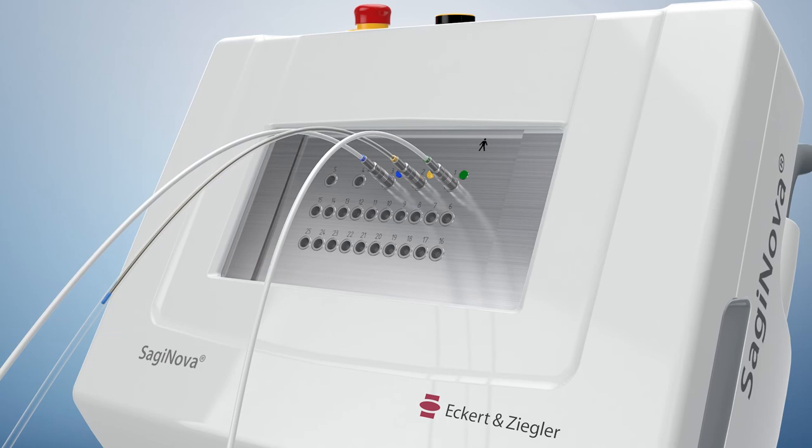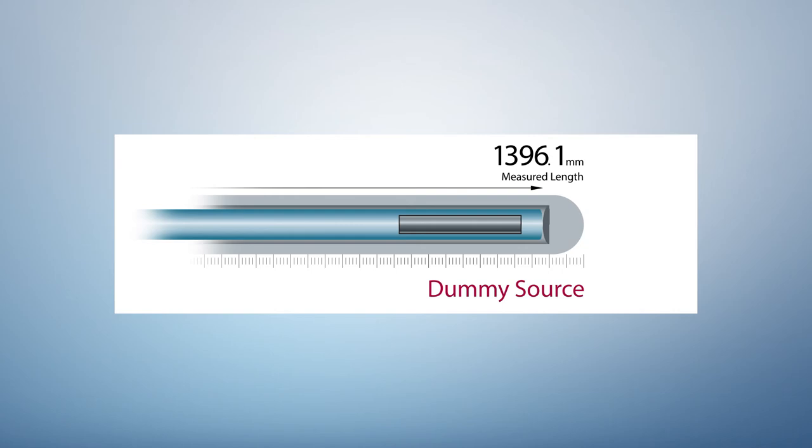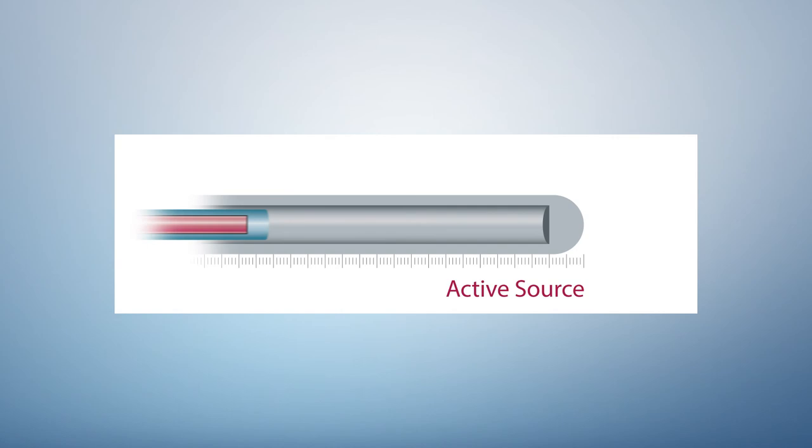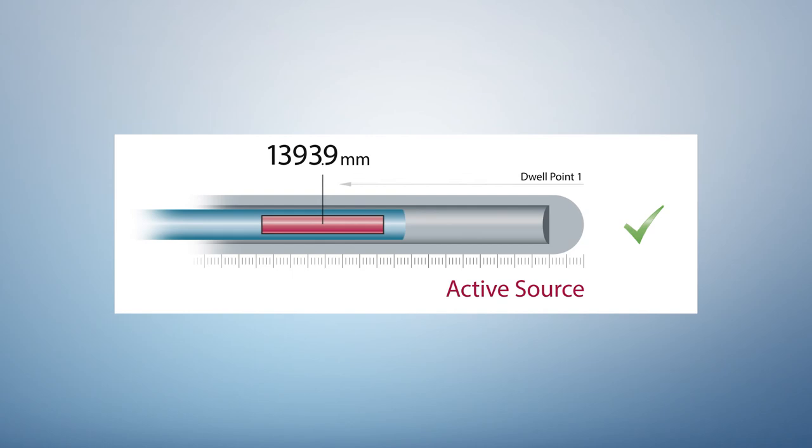Prior to each application, the dummy source measures the length of the complete channel to allow for the verification of the correct channel length. The precisely measured length of each individual channel is automatically used for accurate positioning of the active source relative to the tip.